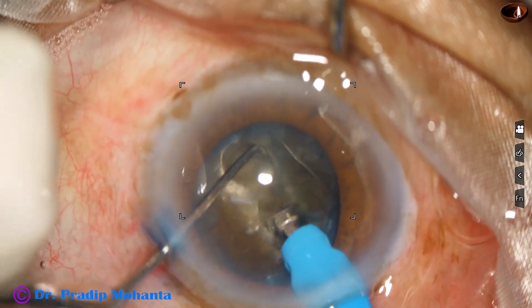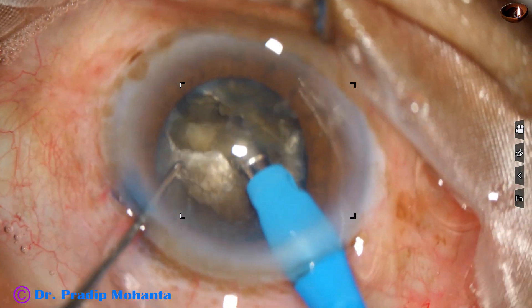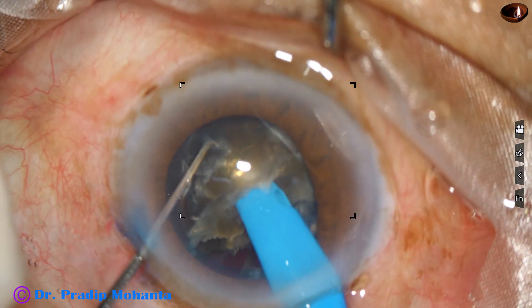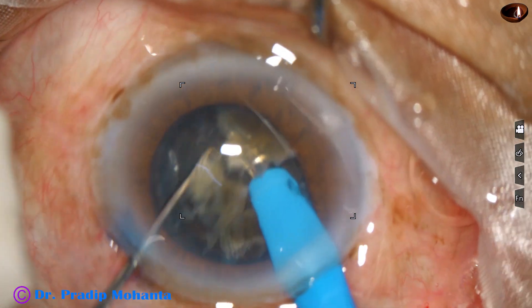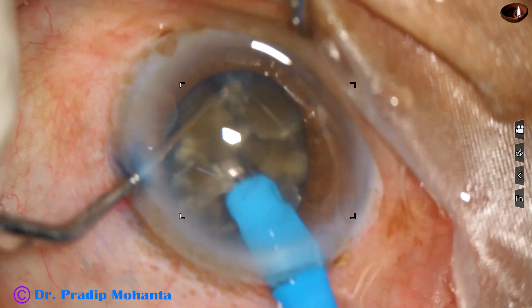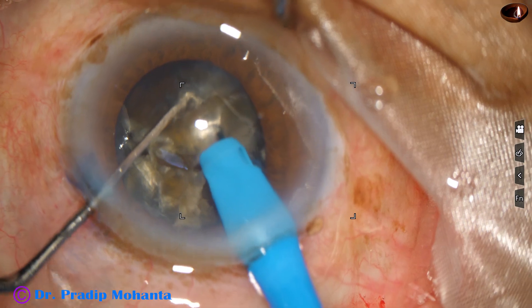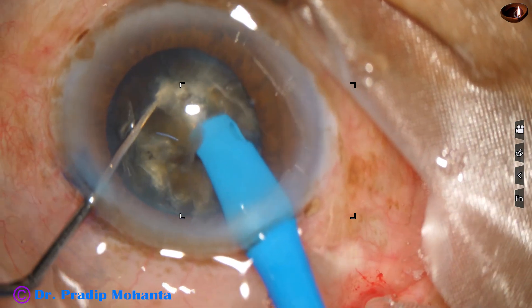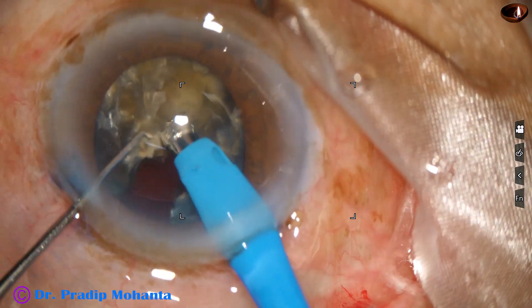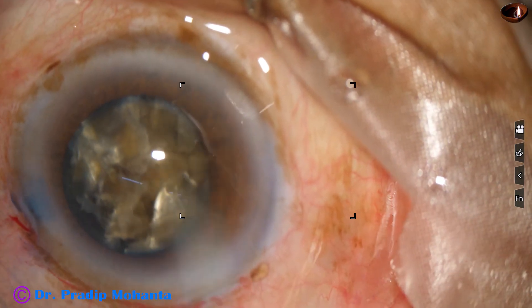Coming to the other side, I find that there is a thick plate on one side. I have got completely two parts, but these are unequal parts — this is the larger part. Dividing this part into three pieces: this is one piece, and now I come — it is not free. Now I divide this piece again into two smaller pieces, and I am not finding any place to engage the phaco needle.